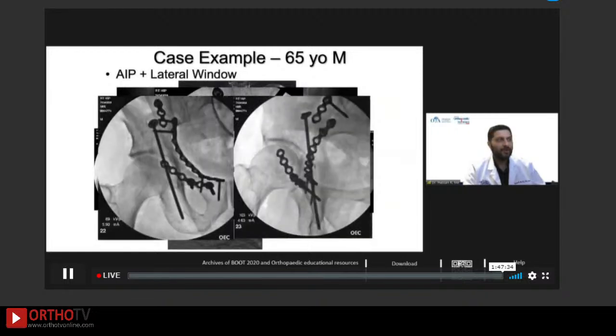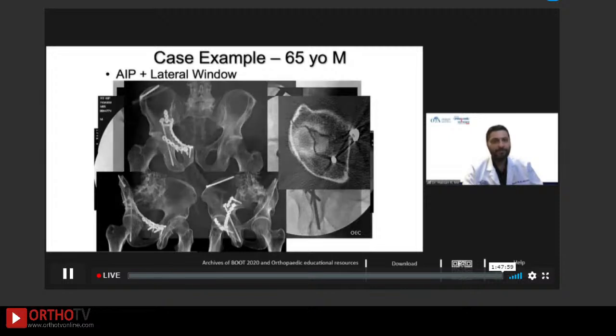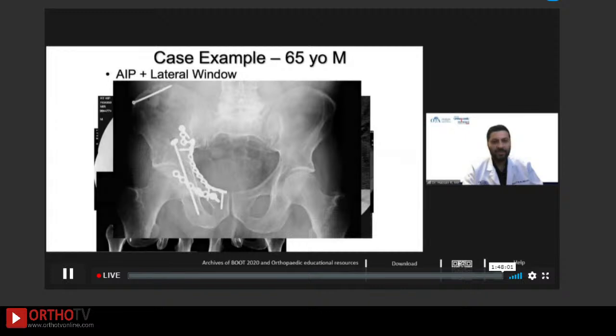And then this was our final construct, which, you know, these are short plates here, but you can easily place long plates above the brim as well, working through both windows. And so this is the final CT scan and shows that we were able to get the dome impacted segment back to a good alignment. The columns look good and the rest of it's well aligned, working through these less invasive, although still dangerous approaches. And this patient healed.